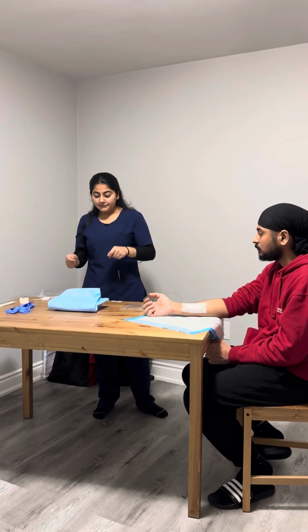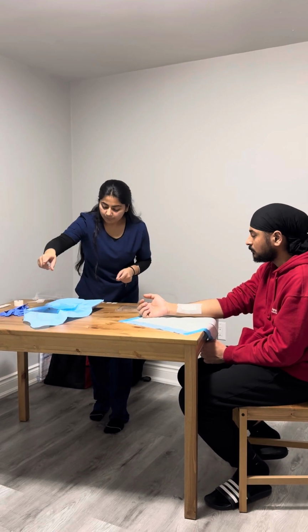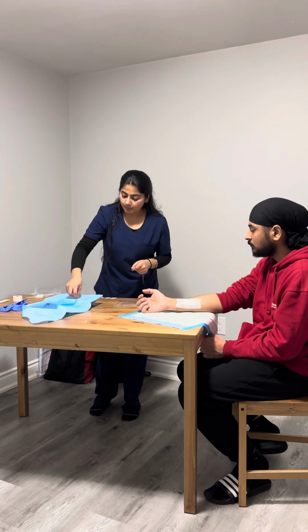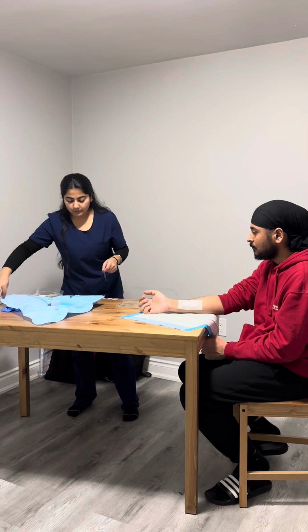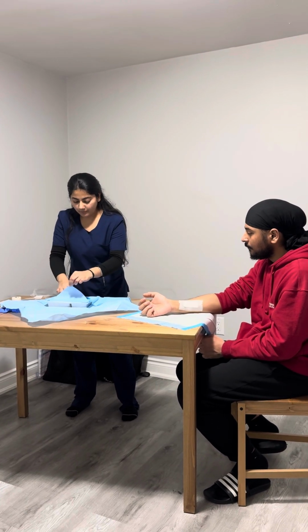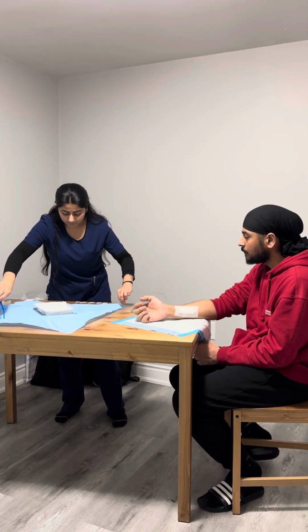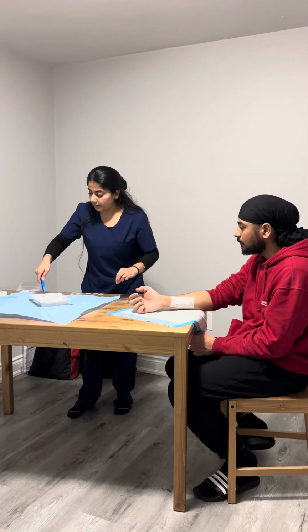I'm going to open my dressing tray in an aseptic technique. So the first swab goes away from me. Second swab goes away from me. Third swab goes away from me. And then the fourth swab towards me, but I can adjust it this way. I will manipulate the supplies according to my reach.